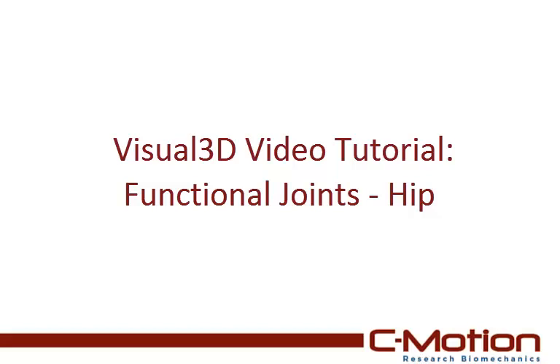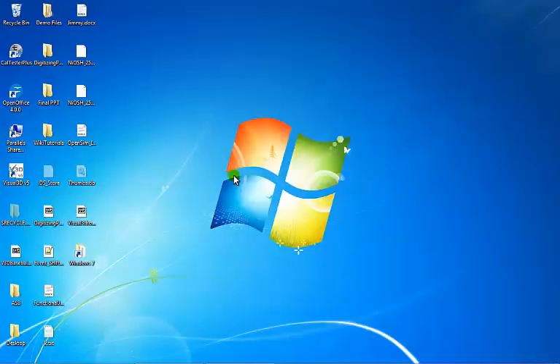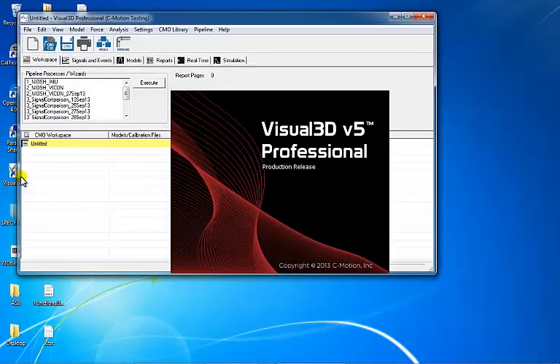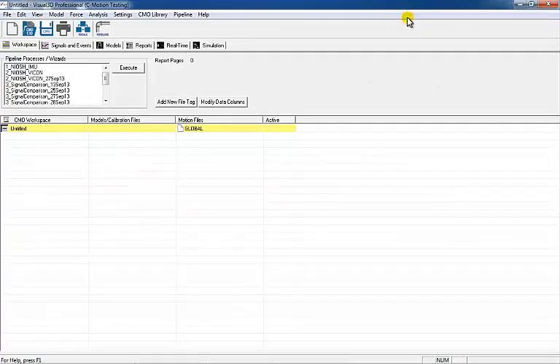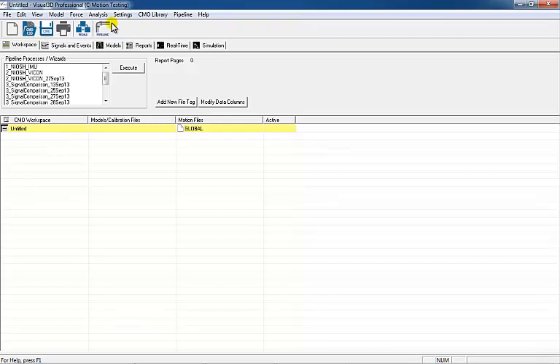This tutorial will explain how to define a functional hip joint using Visual 3D's built-in calculations, which were adapted from Schwartz and Rosamalski. For more information about functional joints and the appropriate movement task, please visit the Functional Joint page of the C-Motion Wiki.